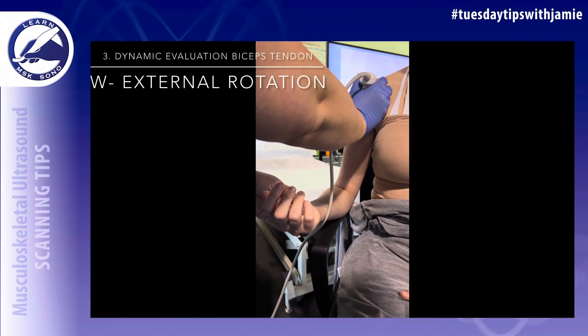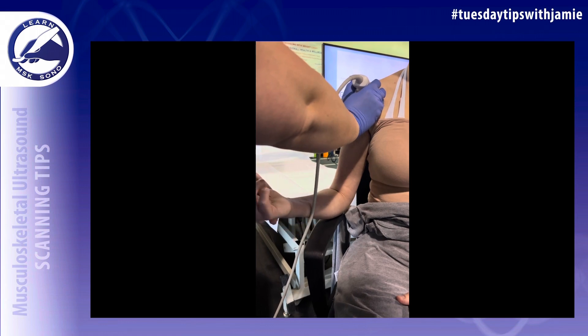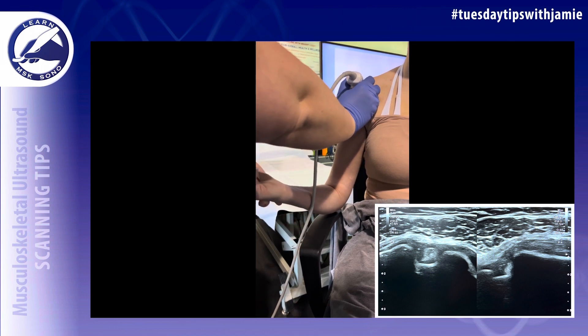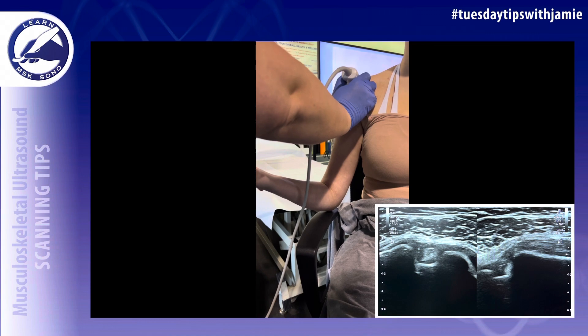To do dynamic evaluation of the biceps tendon, externally rotate the arm and go back to neutral, repeating the motion from neutral to external rotation to check for subluxation or dislocation immediately outside of the bicipital groove.